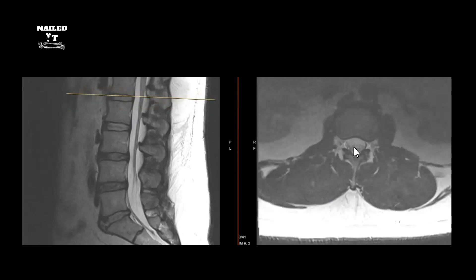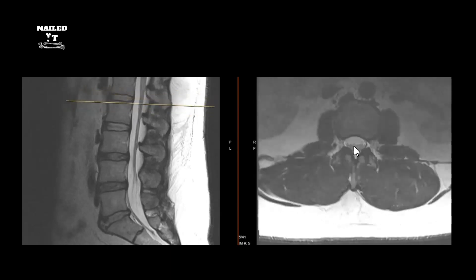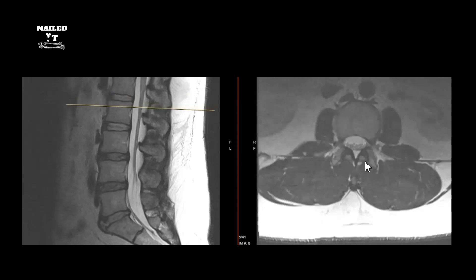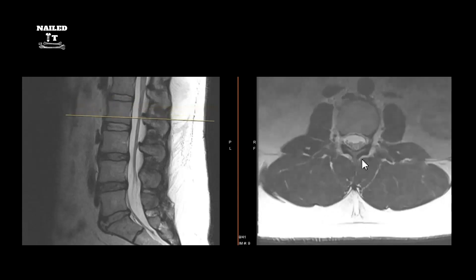Moving to the axial view, you're looking at all these nerve roots as little dots — that's exactly what you want to see. There's nothing pressing onto these nerve roots, and you can see them tracking out through the foramen without any major stenosing lesions.